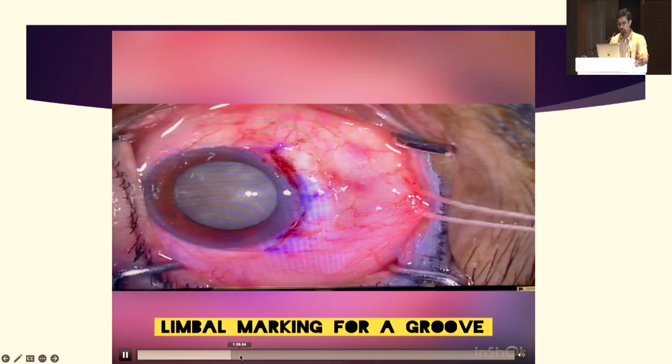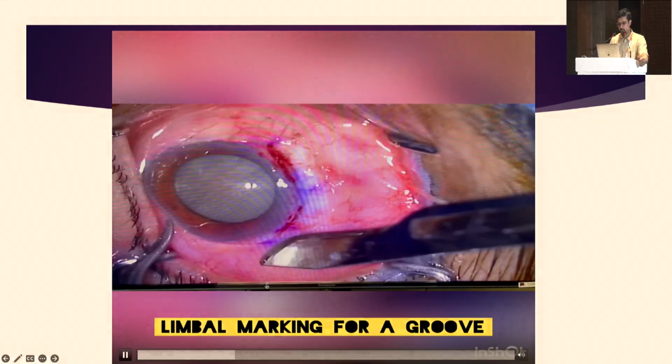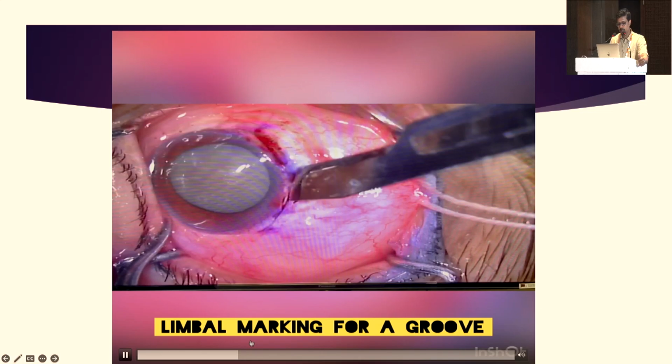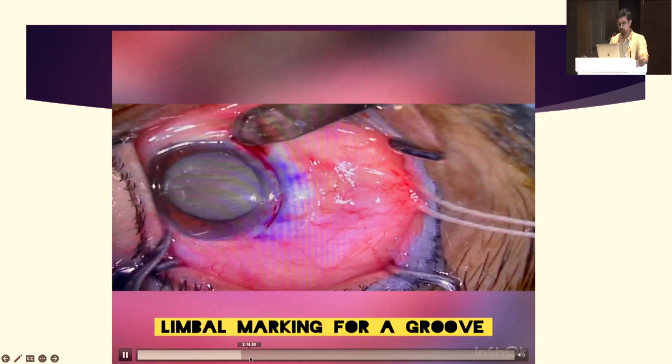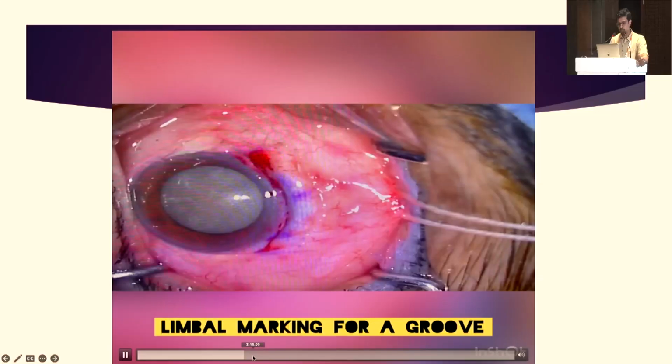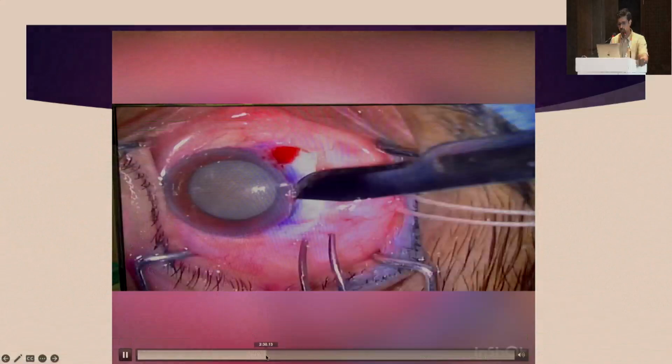He or she stays exactly on the surgical limbus so that complications and bleeding, and extension into the sclera, are avoided. It makes the surgery a lot easier for them, and we encourage them to use a 15 blade and then enter the chamber with an 11 blade.